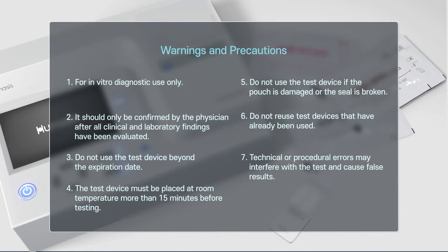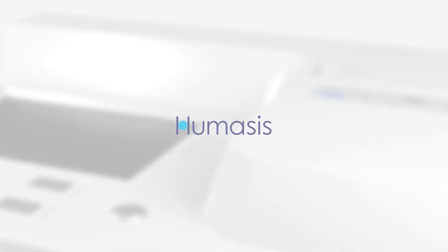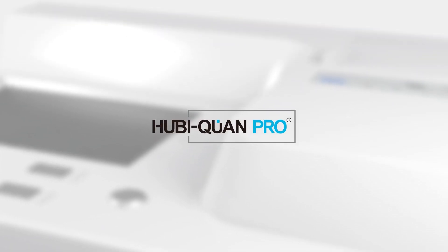Warnings and Precautions: Do not use the test device beyond the expiration date, and follow the guided instructions for testing. Technical or procedural errors may interfere with the test and cause false results. As with all diagnostic tests, a definitive clinical diagnosis should not be based on the result of a single test, but should only be made by the physician after all clinical and laboratory findings have been evaluated. A new standard for the POCT analyzer — Humasis HubiQuant Pro.